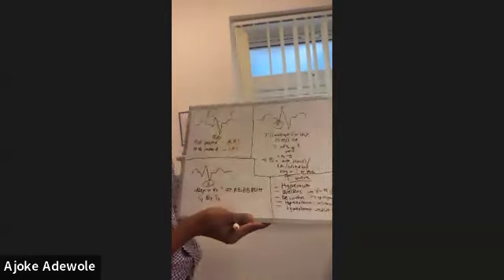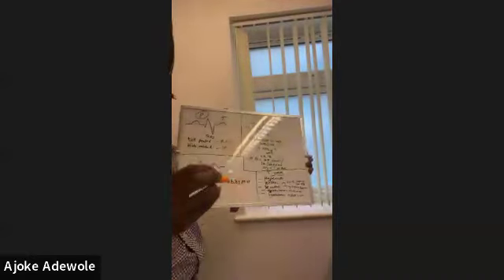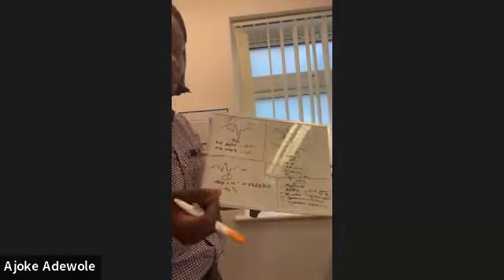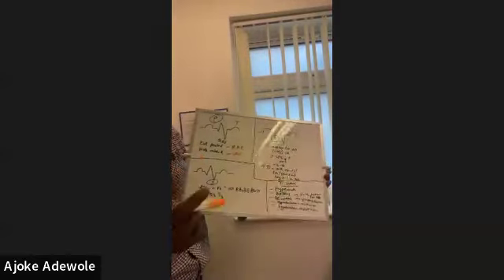Hi, so this is just a quick video. I hope you can see this clearly. I'm just trying this video out and I've just got a few minutes, but in a few minutes, you can learn a lot. I promise you maximum value.